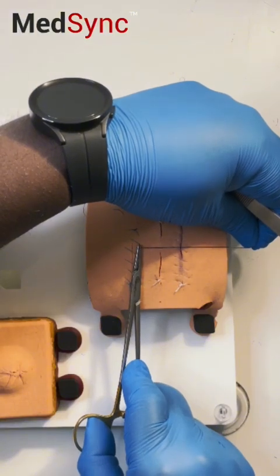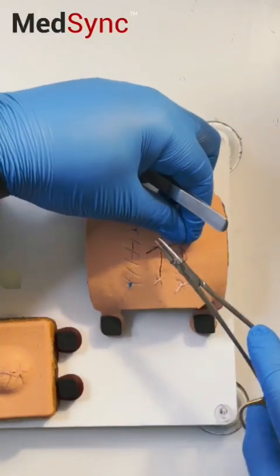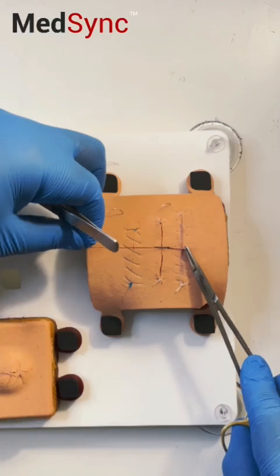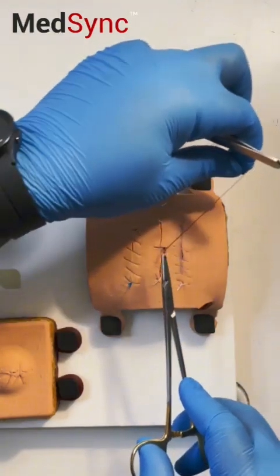Repeat the same steps: wrap it around the tip, pull the short end through the loop, alternate the position of the long and short thread, one more time, and pull through.